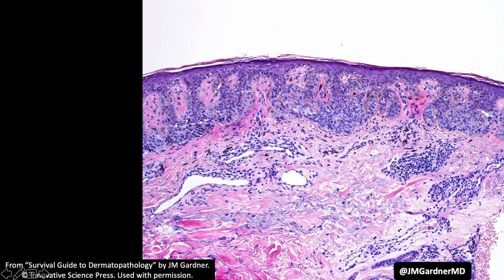Look at all the solar elastosis here. So this is from the face of an old person. I guarantee you, if it looks like a dysplastic nevus and it's on the sun-damaged face of an older person or the scalp of an old person that's got sun damage, that is almost certainly not a dysplastic nevus. And I have seen that mistake made multiple times. Do not call things dysplastic nevus on the sun-damaged head and neck unless you're totally sure, or even I will do it occasionally, but only when I see the whole lesion and I've done stains and I've done everything and I've shown my colleagues, and then with great trepidation and fear, I'll say, okay, I think despite the age and the sun damage, I think it's probably a dysplastic nevus, but if it recurs, you need to excise it, or I add all sorts of hedging language around it.